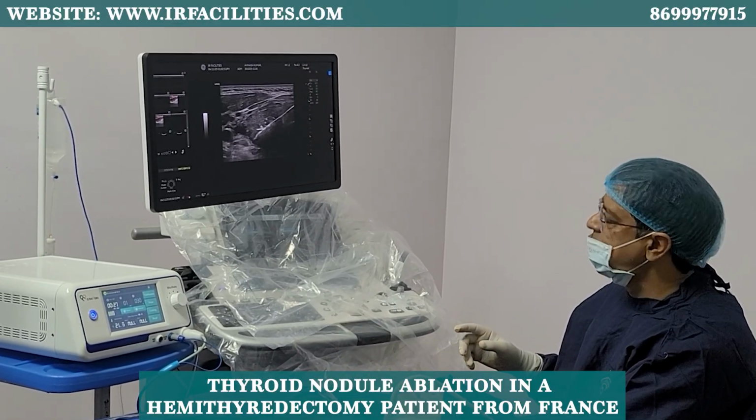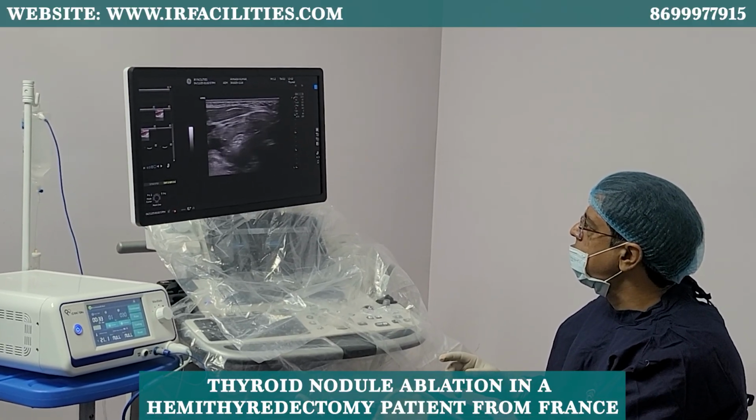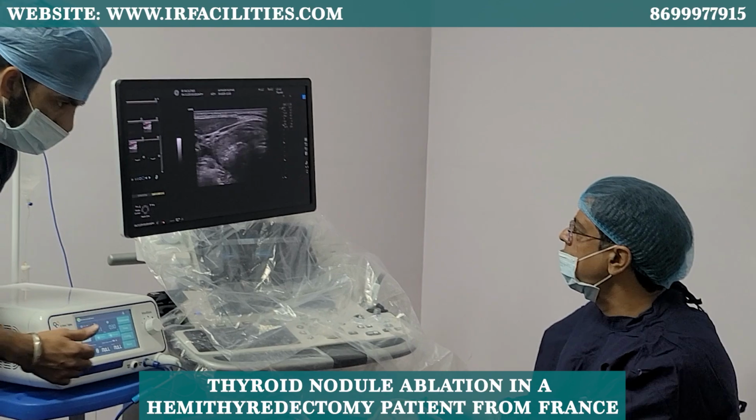Now you won't have much pain, right? Because this is not close to surface. Look.